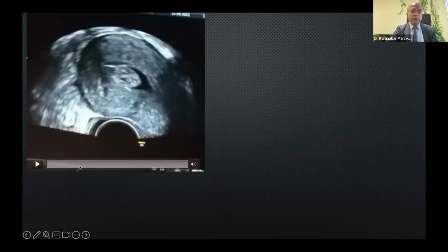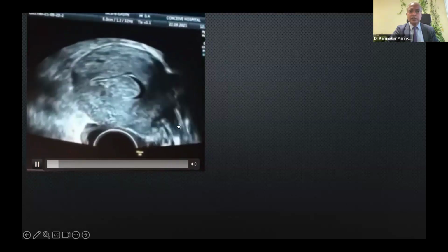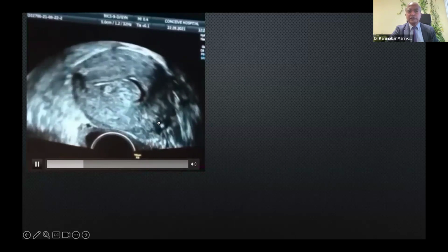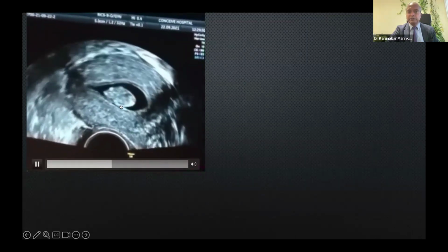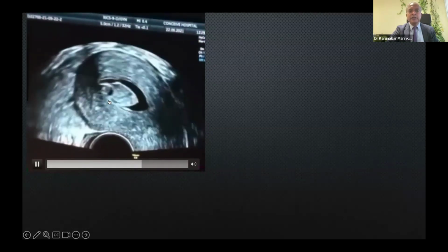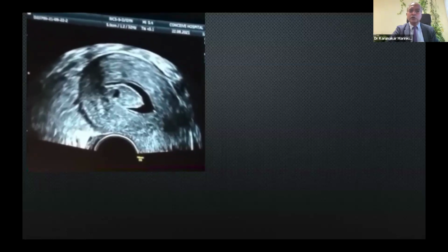Doctors are pathological. So this is just a saline scan. One of my nurses, we just put in any Foley's catheter and put in the saline without air after priming. You can see a polyp. You can see sometimes in a 2D scan the base of the polyp. Whether you have a vessel or not, you must remove them anyway. So vessel or no vessel, you must remove.